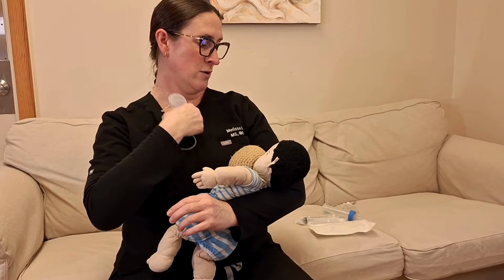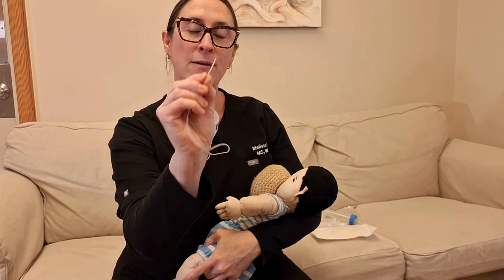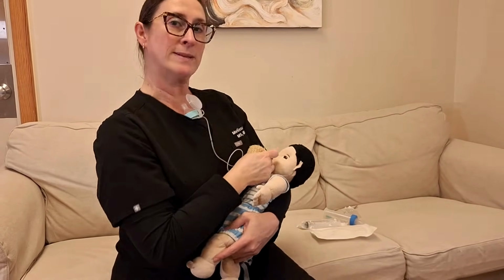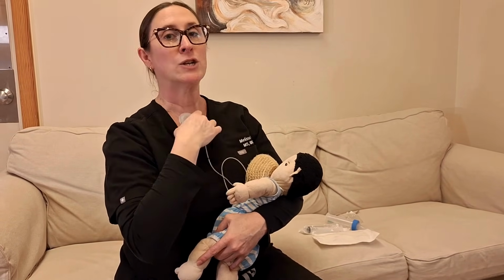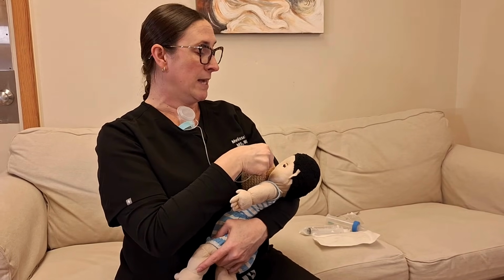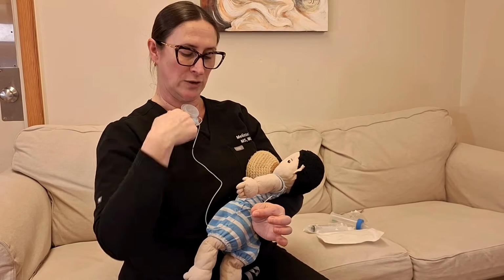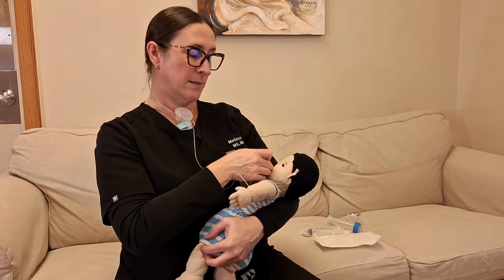We can make sure that it is ready to go, it's clean, and then we take the little top part, the tip of the tube, and while the baby's latched on, we can poke it into their mouth, and when they're actively feeding, you'll see the extra supplementation flow up the line and into the baby's mouth. If they're not active or the tube's not in the right spot, you generally won't see milk run up the line, and then you know we need to position it differently.